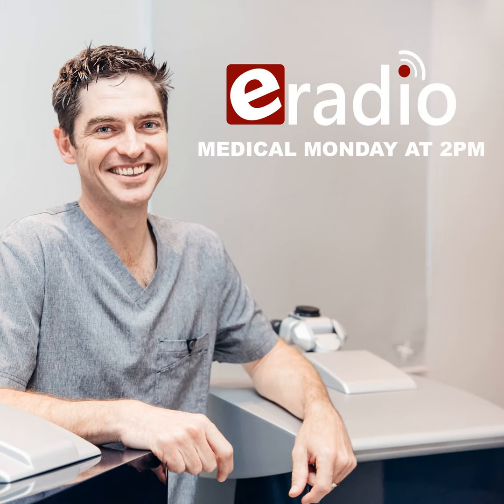At the end of the day, we determine a treatment profile that is going to be safest and best suited to you. So you asked if you can't have LASIK, what does that mean? Sometimes our patients' treatment is too high. So they might be a -8 or -7, but their corneas are too thin. So they're going to be left with what we'd call tissue that's not safe enough to hold its own structure. So then we consider a surface treatment instead.